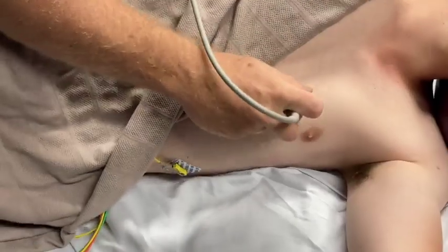Today we're looking at imaging the aorta and how we can think about its position within the chest, and trying to help us to get these images a bit clearer and to interrogate things a bit better. A bit steeper.